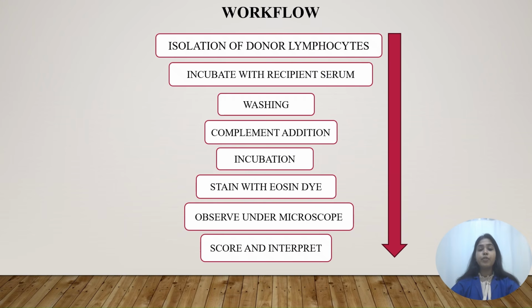Here is the workflow of our test. We'll start with the isolation of donor lymphocytes. We'll incubate with recipient serum. We'll proceed with washing, complement addition, and an incubation. After that, we'll stain with eosin dye. We'll observe under the inverted phase contrast microscope, and at last we'll score and interpret.